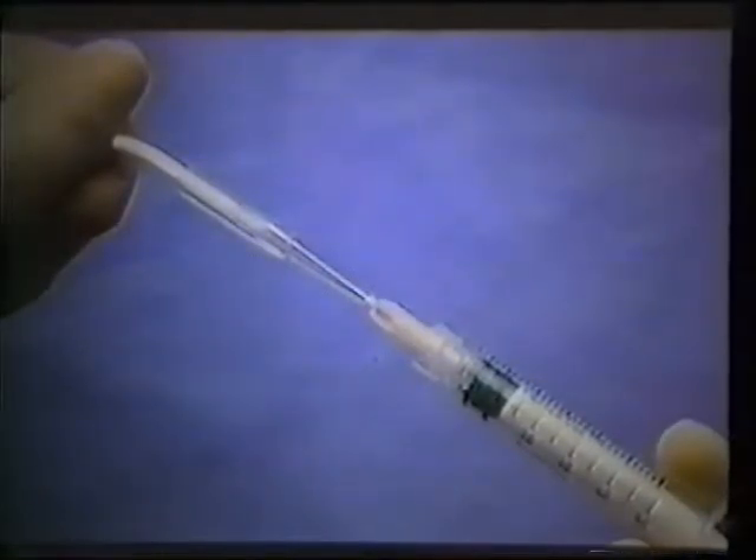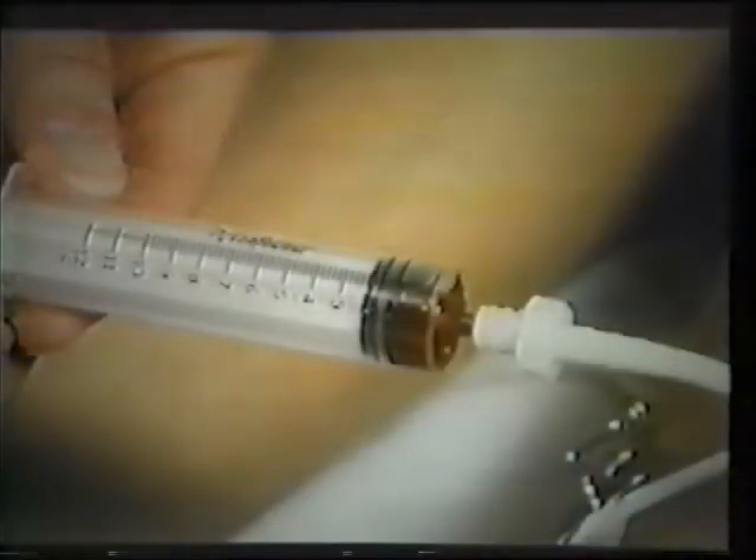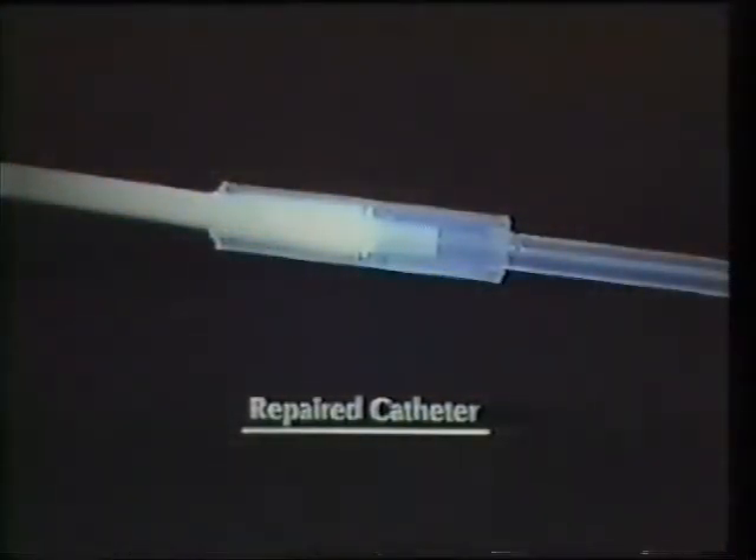Slide the splice sleeve over the connecting ends so that the ends are positioned in the middle of the sleeve. Alcohol may be used as a lubricant to ease movement. Using the blunt end needle, inject adhesive under both ends of the sleeve. Roll the sleeve between your fingers to evenly spread the adhesive, then remove the excess with sterile 4x4 gauze pads. Allow two hours for the adhesive to dry before using the repaired catheter for infusion. To protect the connection while the adhesive dries, splint the joint with a tongue blade, cover with gauze, and tape securely. The repaired junction must remain splinted 48 hours to achieve full strength, after which the splint may be removed. After repair, attach a 6 milliliter syringe to the injection cap end, unclamp the catheter and pull back until blood fills the replacement segment, then clamp and irrigate with normal saline and complete the procedure with a heparin lock.